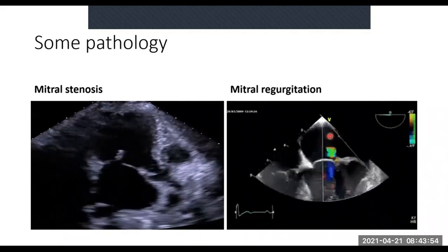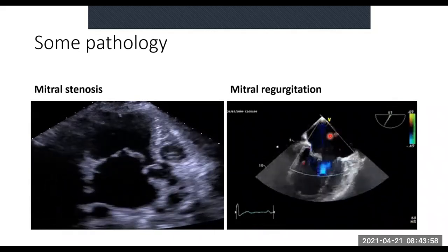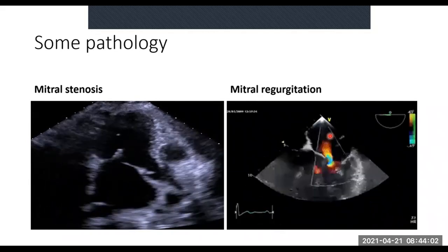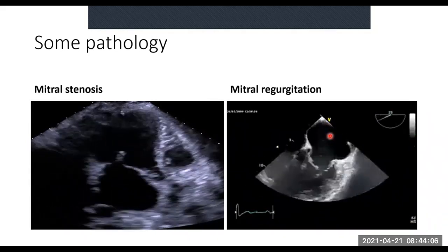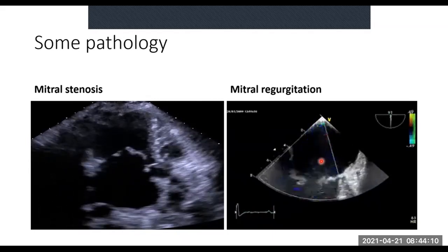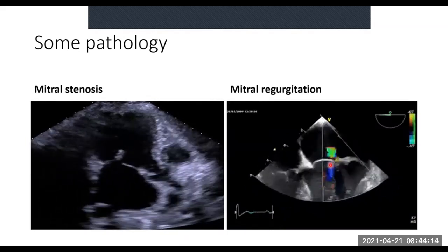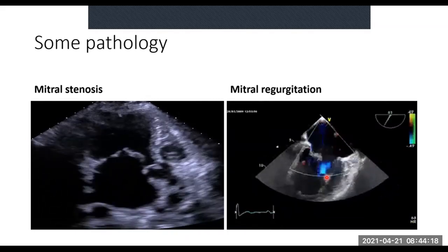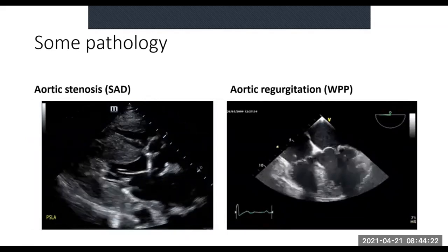And then conversely it also pumps more the next time. So you start getting dilation of the left ventricle as well. You start seeing effects on your blood pressure and things like that. I mean, this is not a tutorial on all of the valve disease. I'm just trying to give you a basic example of what you'll see. But here you can see the regurg, all right? Sorry, let's get it up there nicely. So you can see it just opening up and you see flow going both ways. Okay, so something interesting to see. Let's go to another one.